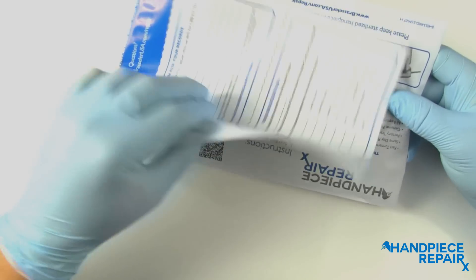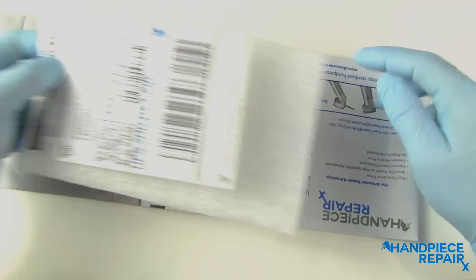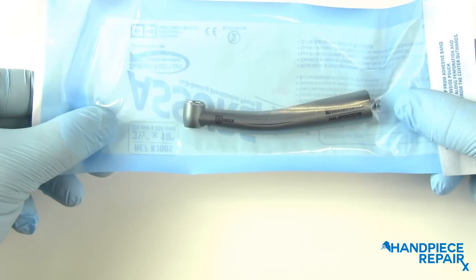Inside the repair packet you will find a UPS shipping label and foam sleeve. Please set these items aside as they will be used later. The first step is to make sure your hand piece has been sterilized.